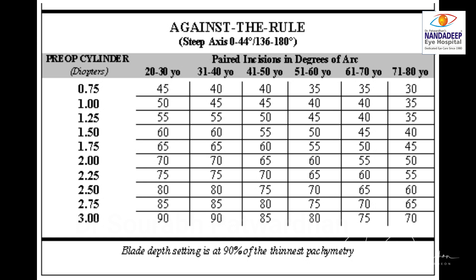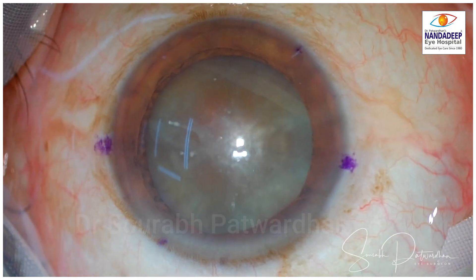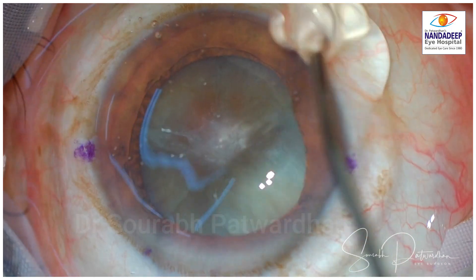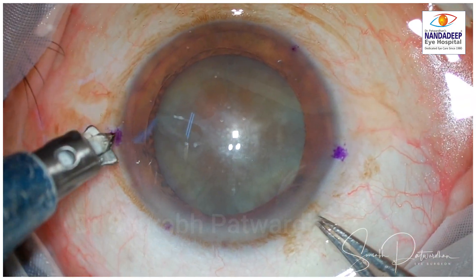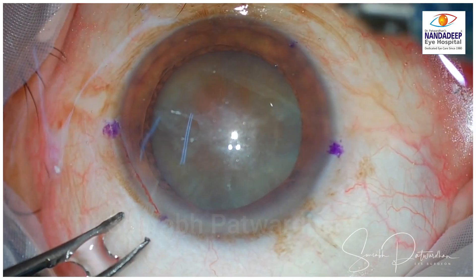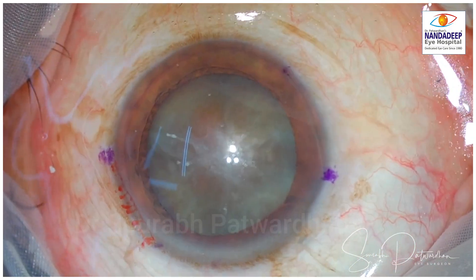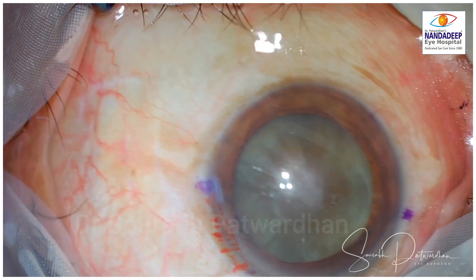Once we see this nomogram, it gives values according to whether the astigmatism is with-the-rule or against-the-rule, and accounts for age as well as the amplitude of the cylinder to be corrected. It will give you the paired LRI incision arc in degrees — I have marked 50 degrees from 130 to 180. This 600 micron guarded diamond blade has to be exactly perpendicular to the cornea where I am making the limbal relaxing incision. Try to make it as uniform as possible to have the best effect.